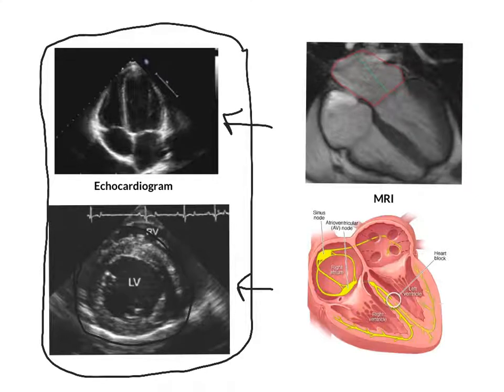And in the next one, I'm going to show you some live images, as soon as I figure out how to put them in the presentation, of what the echocardiograms look like. The MRI is also live and can show quite a bit too. Shows chamber size, and the one issue that they have is blood flow. We can see blood flow on the echocardiograms by just turning on what's called Doppler. We have color flow Doppler, which just shows us the flow going through in a bunch of different colors. I would go into the explanation, but it's way too complex.